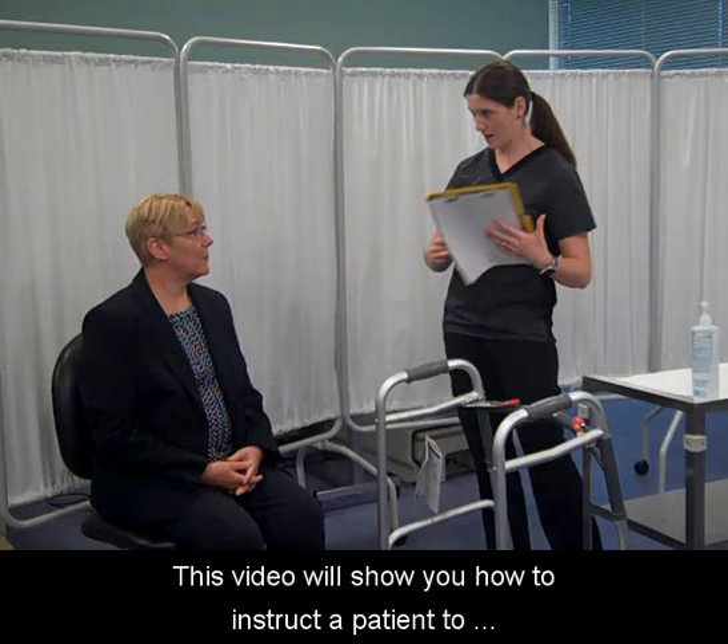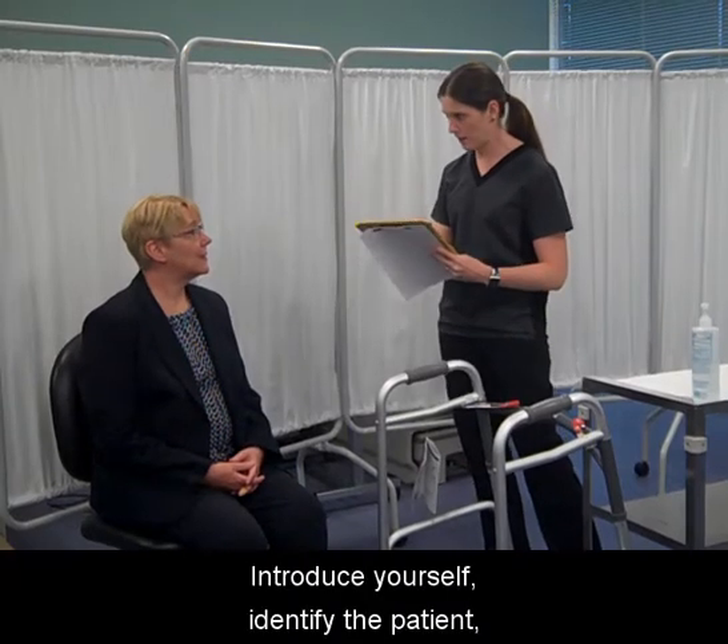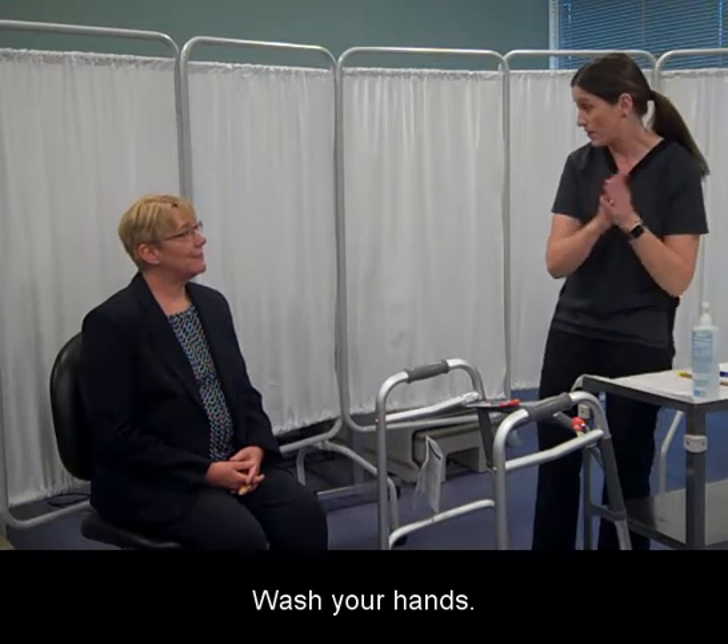This video will show you how to instruct a patient to correctly use a walker. Introduce yourself, identify the patient, and explain the procedure. Wash your hands.